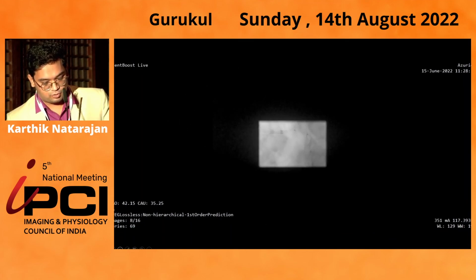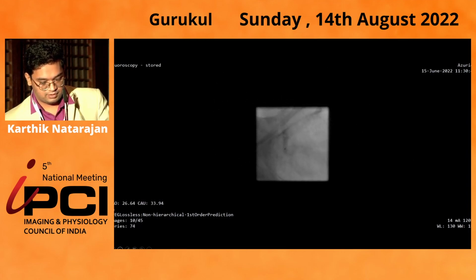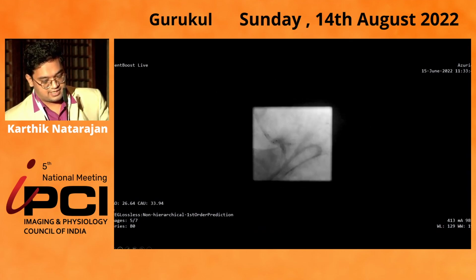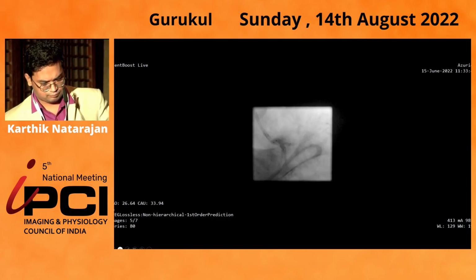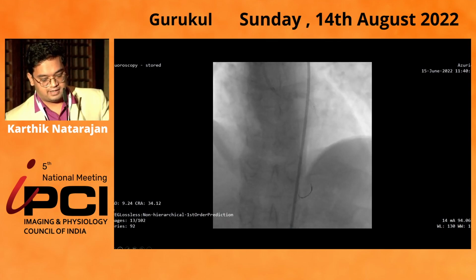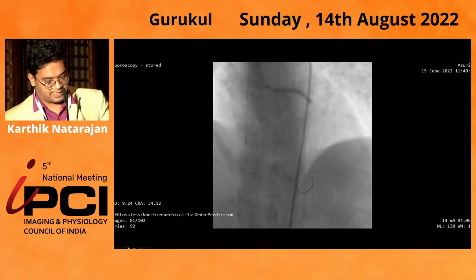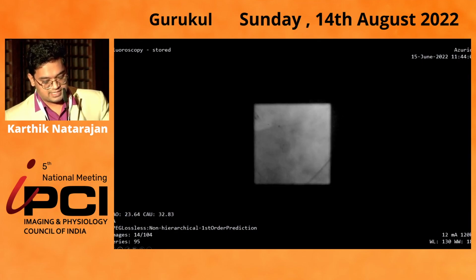Then we made efforts to cross through the proximal strut, opened the struts up with a 2.5 millimeter balloon, and post-dilated the circumflex stent. We did the first kiss with a 3.5 millimeter balloon in the LAD and the circumflex, removed the circumflex wire, and deployed a 3.5 by 38 stent from the ostium of the left main. We flared the ostium of the left main with this stent balloon and did proximal optimization with a 4.5 by 8 millimeter balloon.